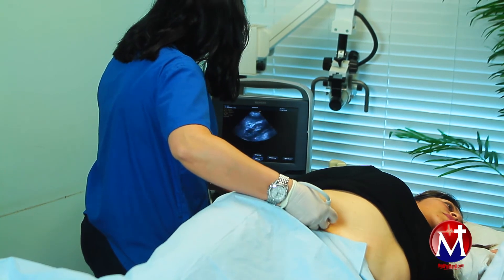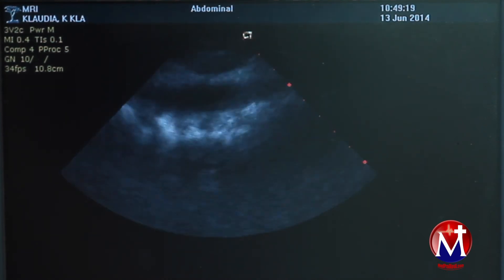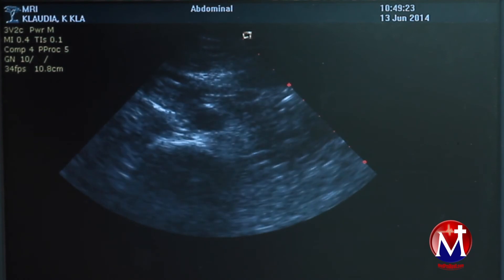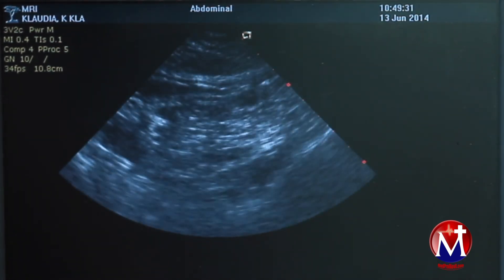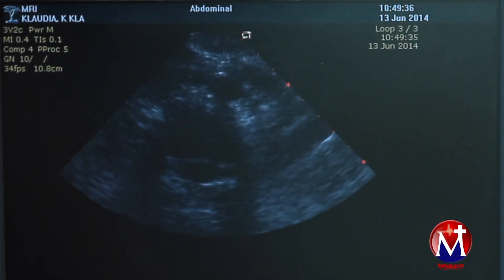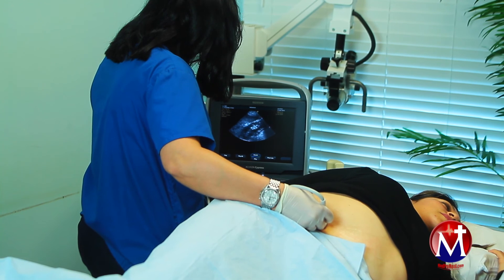In patients who have a history of pancreatitis, the pancreas is assessed for its texture, its size, if there is any pancreatic ductal dilatation, or any fluid collections near the pancreas. In patients who have elevated amylases or bilirubins on their blood work, ultrasound is an extremely useful tool to assess the pancreas as well as the biliary system.